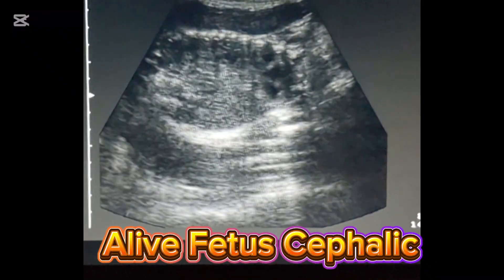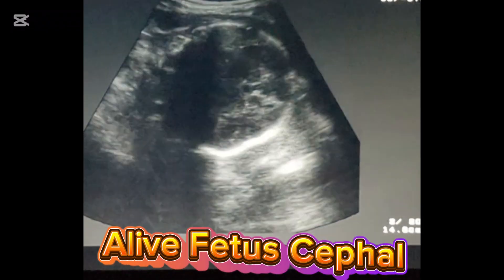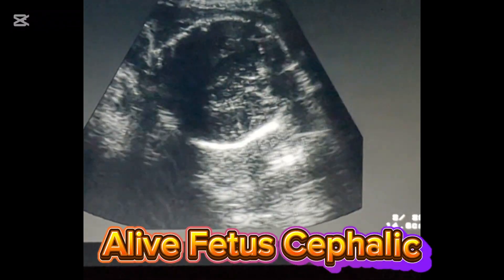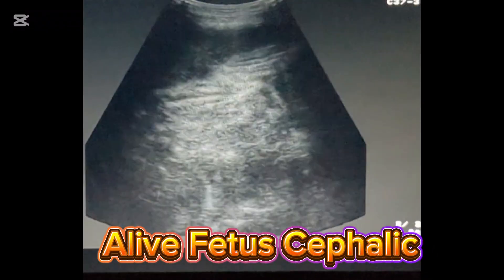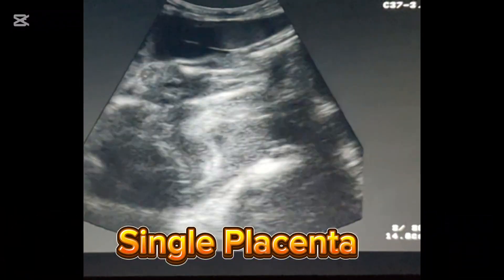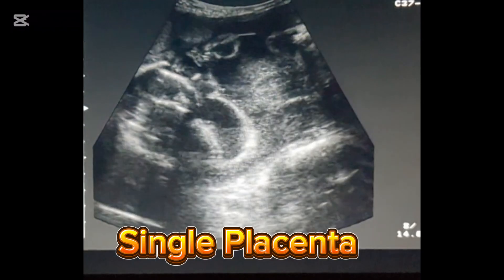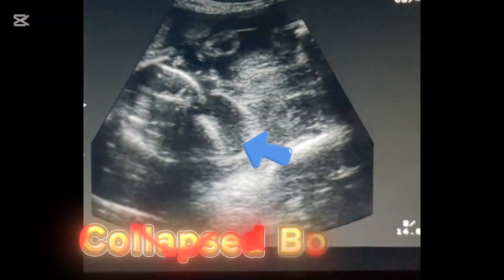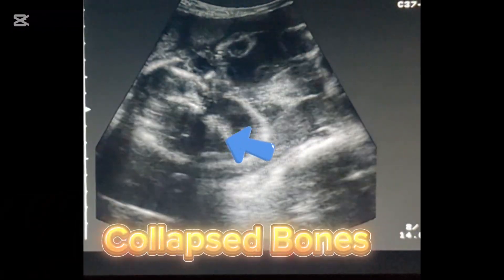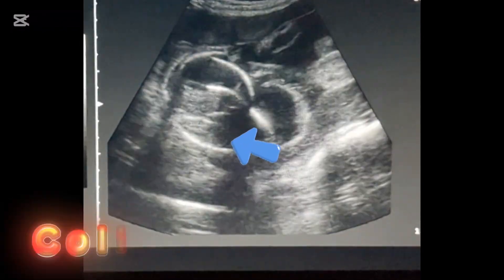The alive fetus is in cephalic presentation with mild oligohydramnios. There is a single placenta and the separating membrane is also shown.